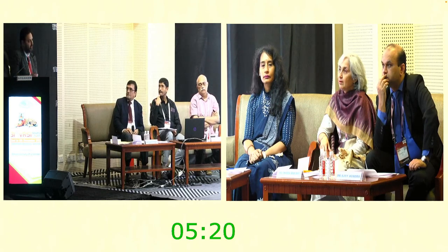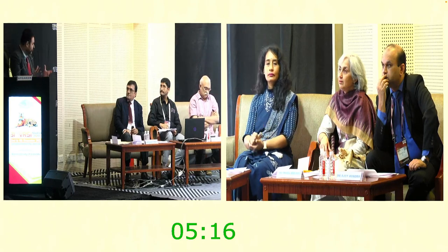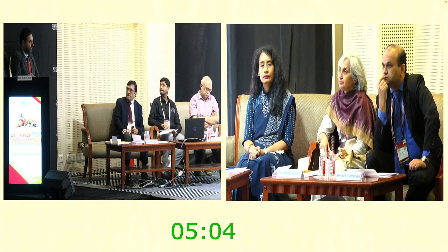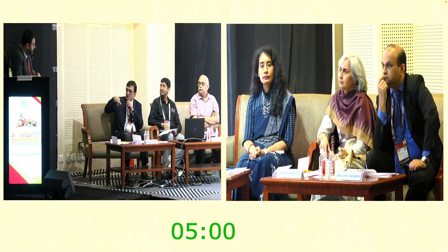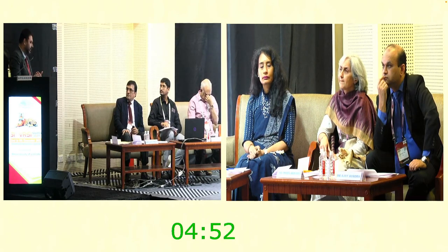So regarding the gauge, sir, in general I do 25 gauge surgery across the board, as do most people in PGS. Our setup, all the instrumentation with 25 gauge is what we tend to have most of the time. So it's a preference that way. 27 gauge would work absolutely fine, sir, just for aspiration, but not the vitrectomy. So once we have those 25 gauge ports, I don't think it's going to make a difference. Regarding why we don't use a 41 gauge, that's also linked to the answer of your third question, sir.